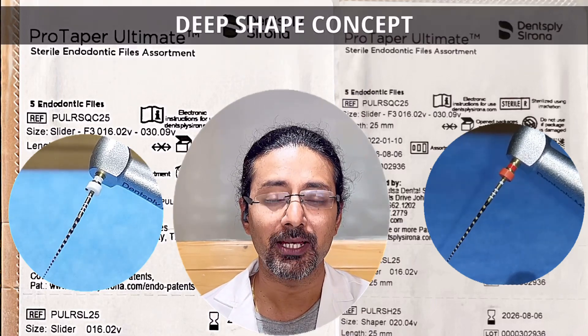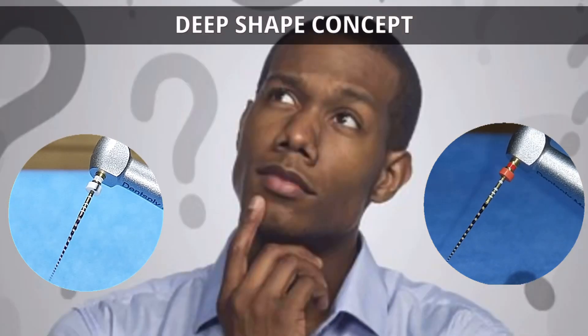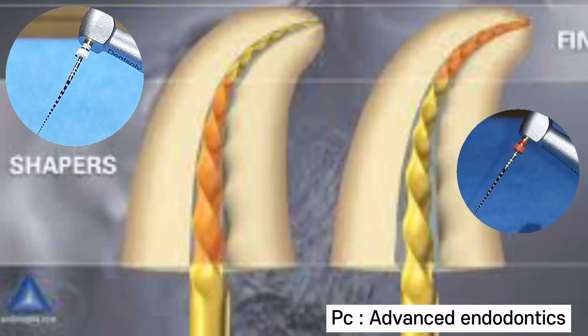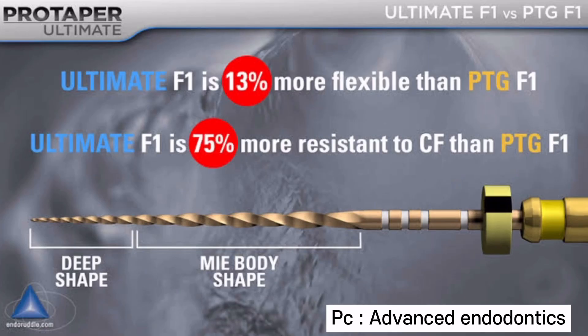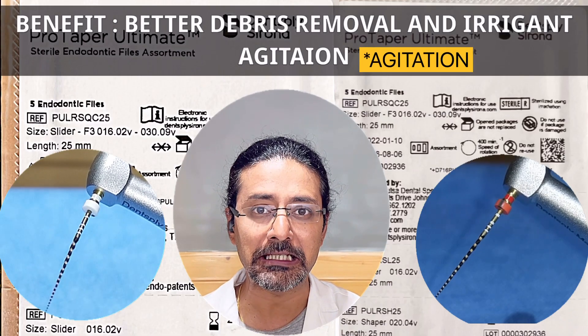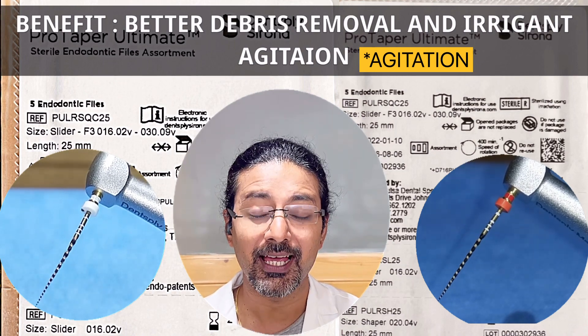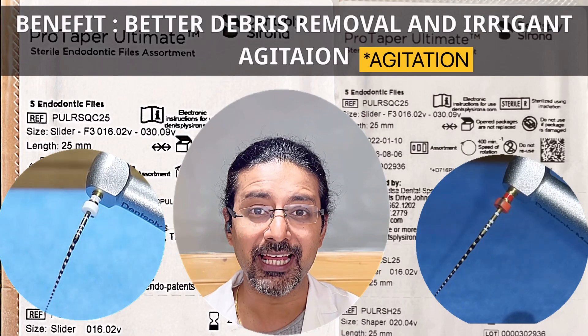The major concept and logic behind Pro Taper Ultimate Series is based on the Deep Shape Concept. Deep Shape Concept is to maintain the apical extent of the root canal as small as practical with a greater or sufficient taper, so that we can achieve greater deep placement of the irrigant and the irrigating needle, as well as irrigant agitation.